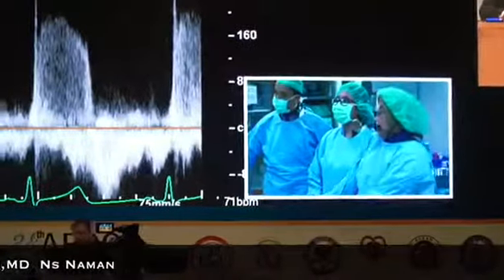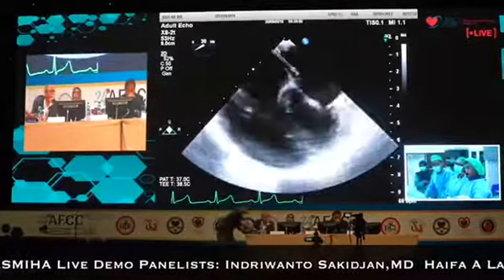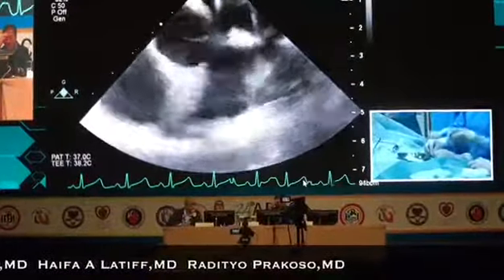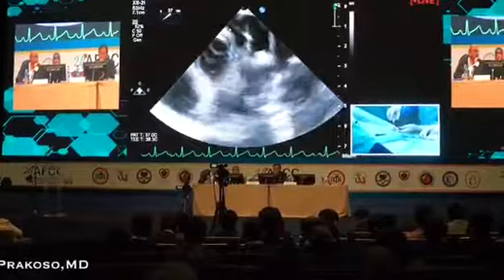With the non-fluoroscopy technique, we now avoid using X-ray to do the intervention and diagnosis in congenital heart disease. The catheter is now on the left upper pulmonary vein. Dr. Oyofi keeps the wire on the left upper pulmonary vein. You see the bubble coming from the pulmonary vein?